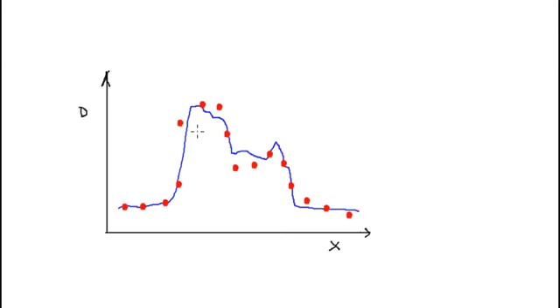So in that setting, you've basically got 2 options. So one is you go back and use film, okay, because that has a very high resolution. You can insert film in a phantom, and you can measure it and do the dosimetry and compare it to the treatment plan, and we sort of went through a bit of that in the previous lectures. There are disadvantages to that. It's not immediate. There's calibrations that are needed that are complex, and so on.